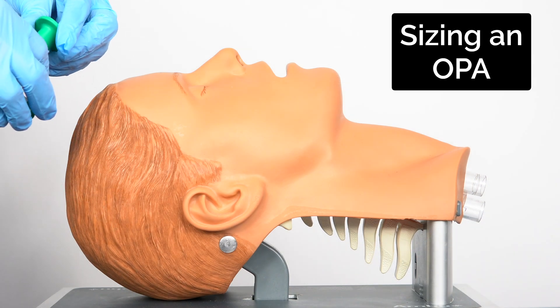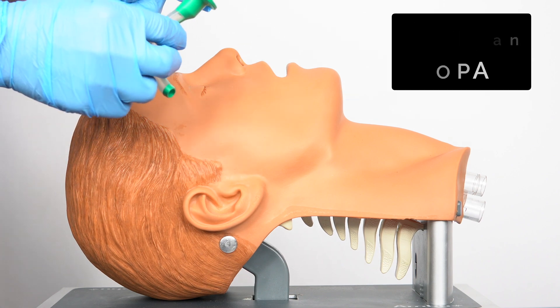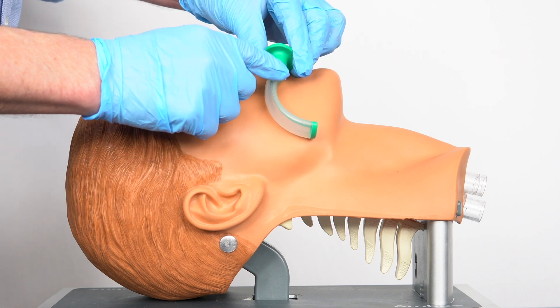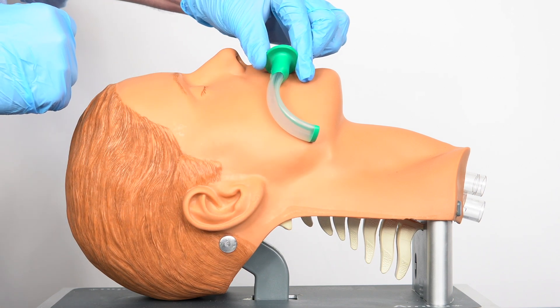When sizing an oropharyngeal airway it's important to make sure that it's going to fit correctly with the patient you have in front of you. You want to line the flange up with the patient's incisors and then follow the curve around so the tip of the airway will sit roughly where the mandible is. So this looks like it will be about the right size.